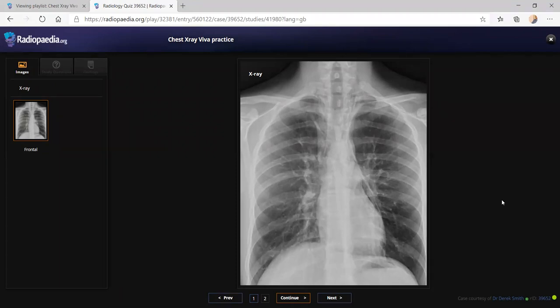The mediastinum appears to be within normal limits. However, I can see there is slight thickening of the right paratracheal region. Both lung fields appear to be unremarkable. Costophrenic angles are free. The bones and the bony cage appear to be unremarkable. Okay, so this is a 20-year-old, and I'm suspecting that he appears to be a tall person, I think. So the presence of this pneumomediastinum could be attributed to Marfan's because of the appearance of the heart, and it looks ribbon shaped, as if the chest is hyperinflated or something. I'm not sure. I would review the previous X-rays for this patient.